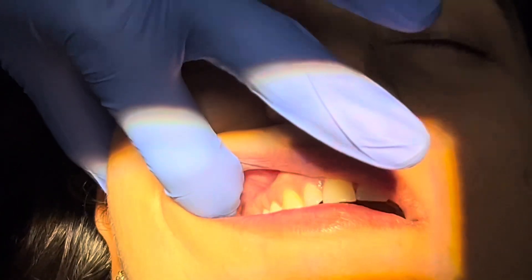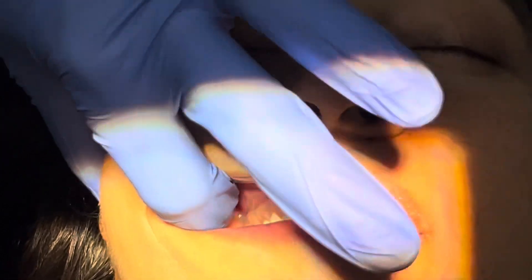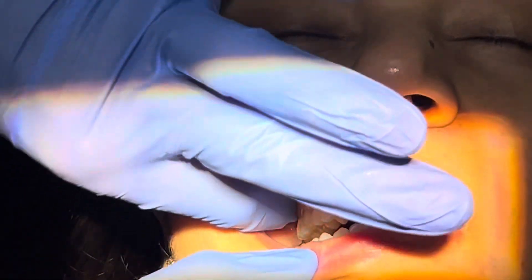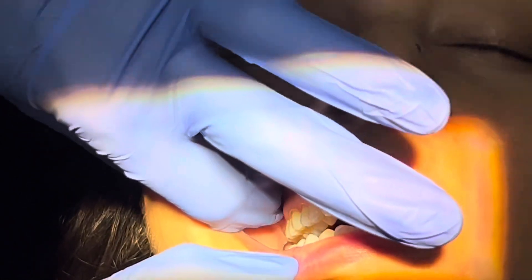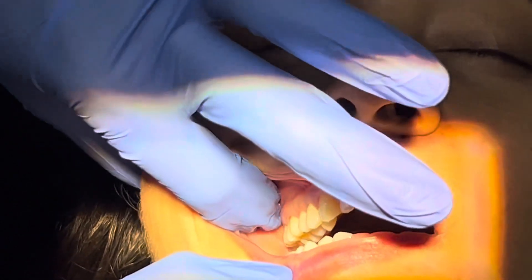We try to palpate — this is the zygomatic process of the maxilla. We place our finger behind this process of the maxilla, and this is the infratemporal surface of the maxilla. There is a concavity here; right now I am feeling the depression, so I am placing my finger there.